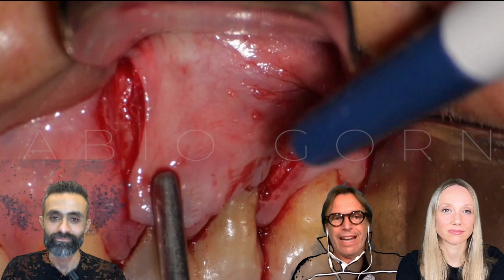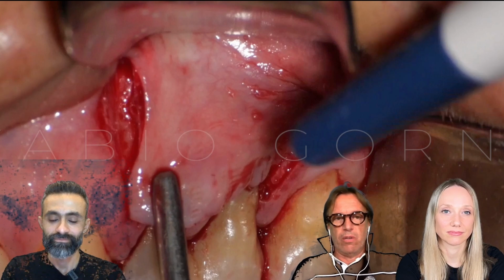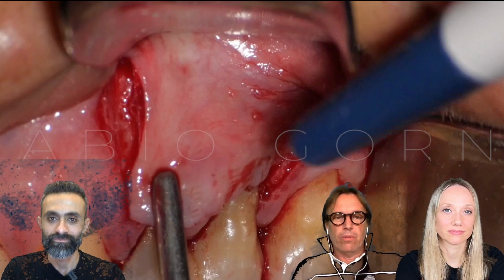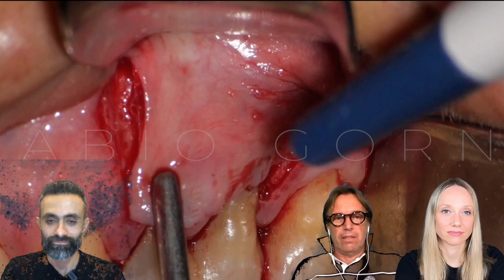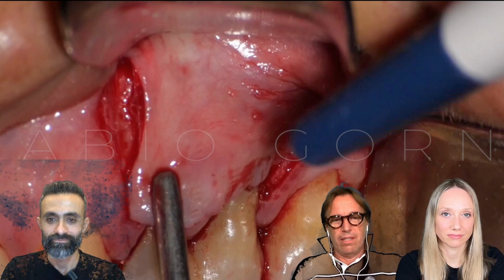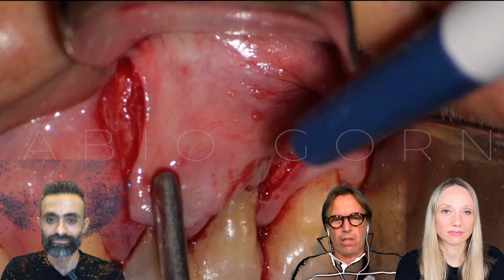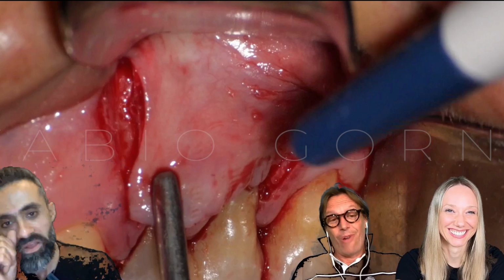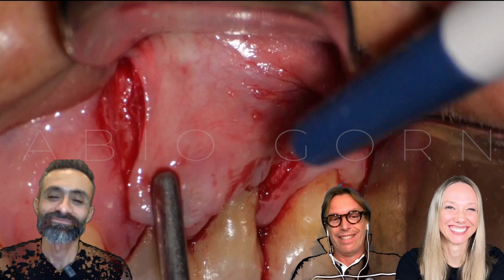But 90% of the time, I'm still using Super EBA because it's simpler to use and doesn't change anything in terms of success rates. Is it rational or not? Perfectly. Yes, absolutely.